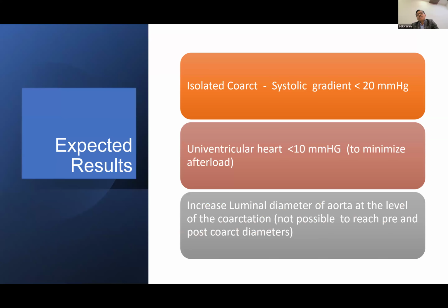And also, a few studies have quoted that in newborns also, especially in recurrence, suppose you have done the balloon at 2 months and it recurs at 4 months, you can do a partial inflation with high pressure balloons like coronary balloons of size 4 and 5, and then go for the other balloons, upgrading the balloons. So high pressure coronary balloons can be used in smaller children to inflate at the same size of the coarct segment, just 1 millimeter extra of the coarct segment to inflate the narrow segment.